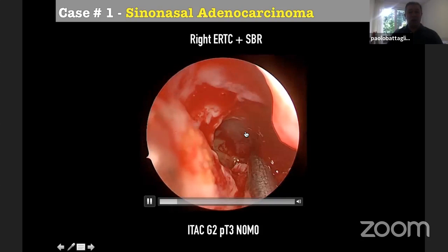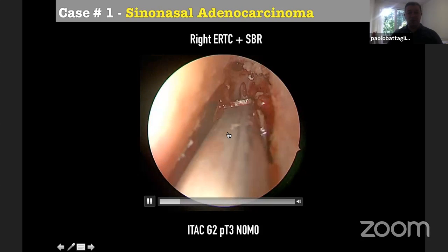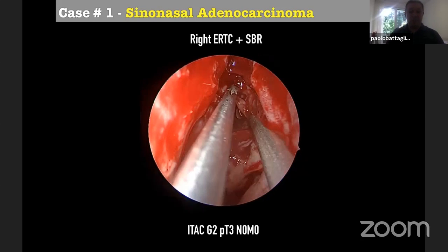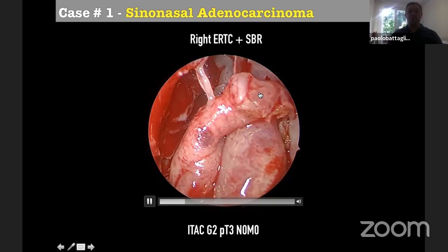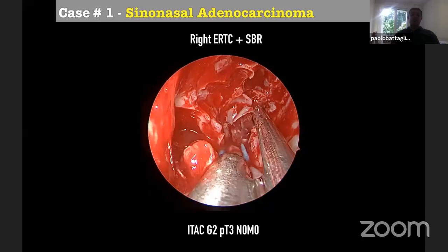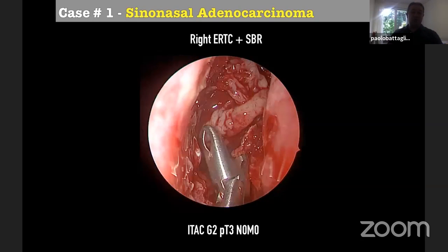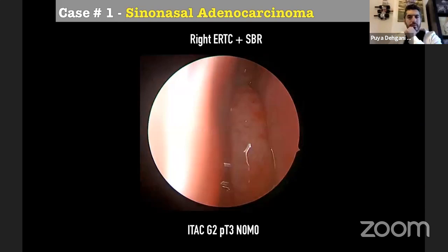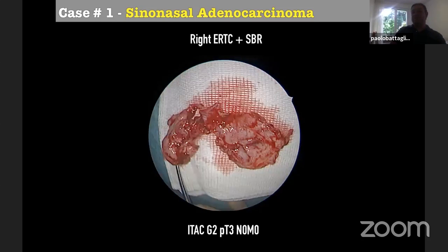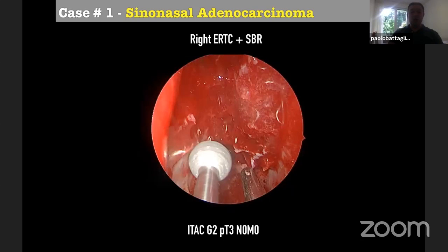We need our landmark, so we open the maxillary sinus, and then by a periosteal dissection, we dissect the ethmoid and the upper part of the roof of the ethmoid and the olfactory cleft. So we remove the ethmoid with the tumor inside. You can see we try to remove it en bloc if we can, but you know this is not a dogma. We can also remove the tumor in a multilayer fashion. The goal is to have free margins.